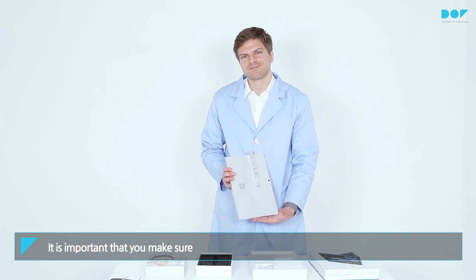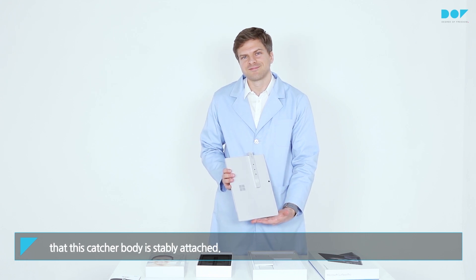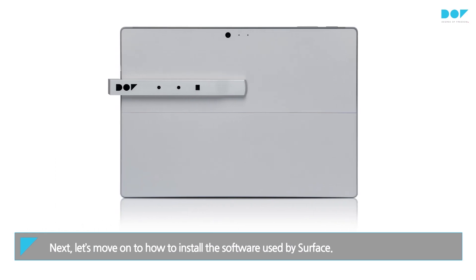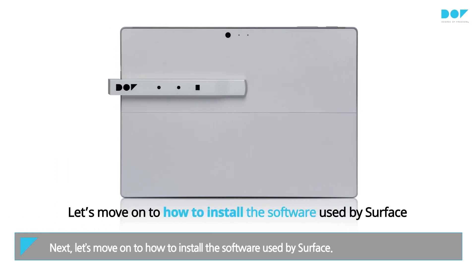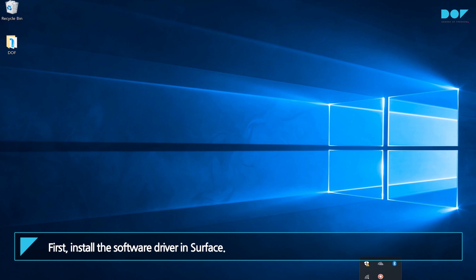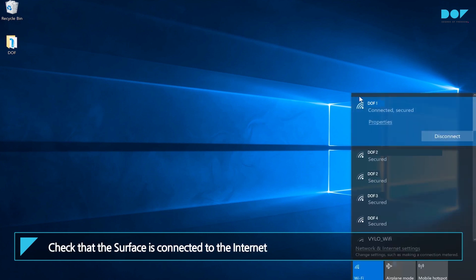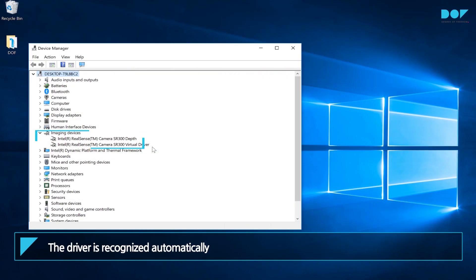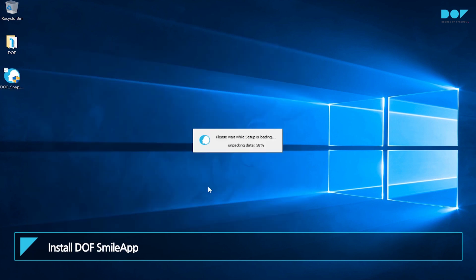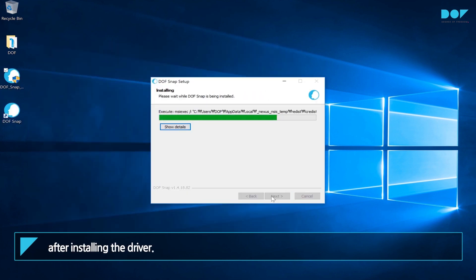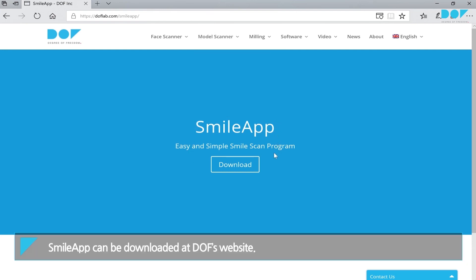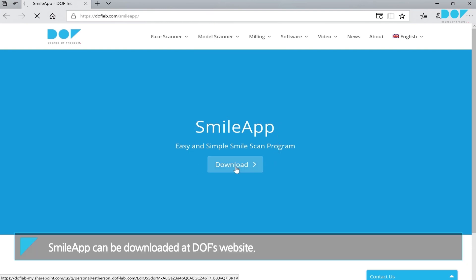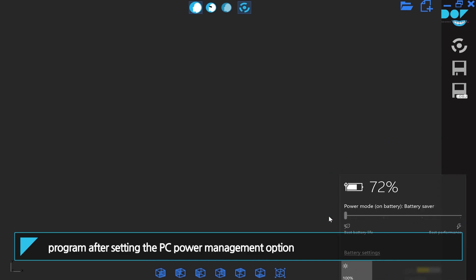Next, let's move on to how to install the software used by Surface. First, install the software driver in Surface. Check that the Surface is connected to the internet before installing and connecting Snap to a USB port — the driver is recognized automatically. Install DOF's Smile app after installing the driver. The Smile app can be downloaded at DOF's website. It is recommended to use the program after setting the PC Power Management option to High Performance.